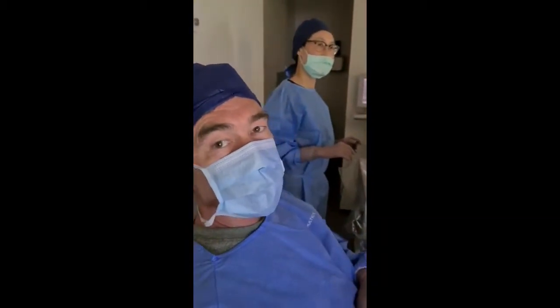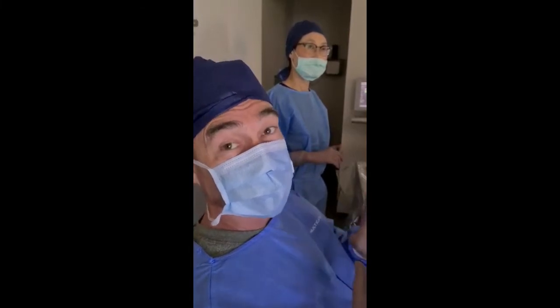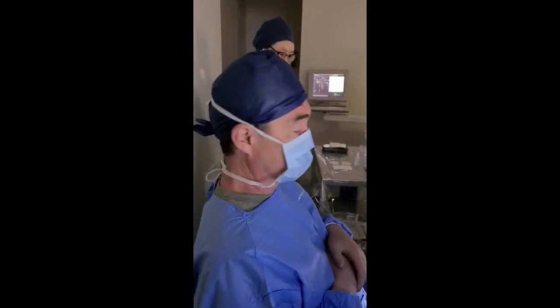This is the Schwind Amaris PRK module which uses no-touch laser. I don't actually have to touch the patient and it's remarkably quick. We're going to do about a three and a half diopter treatment.